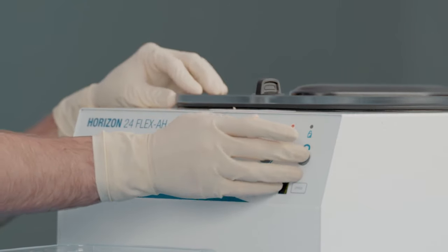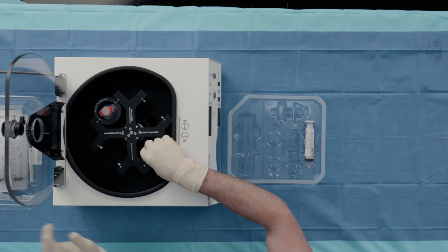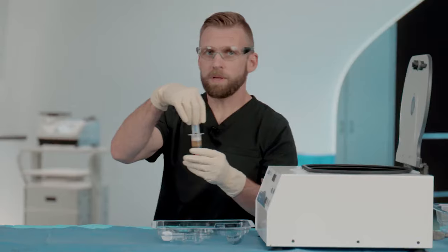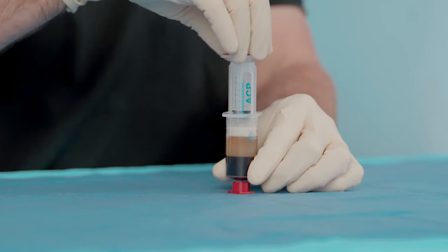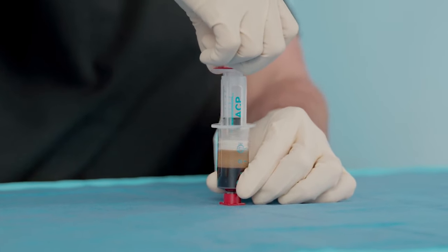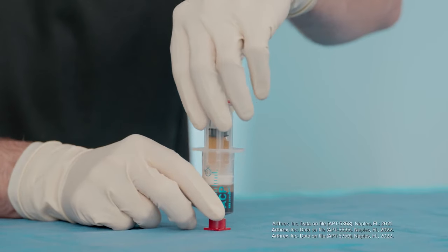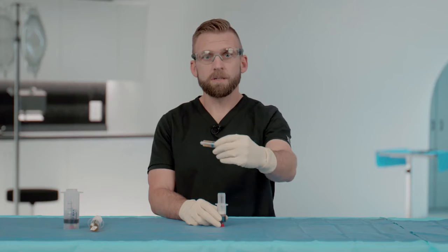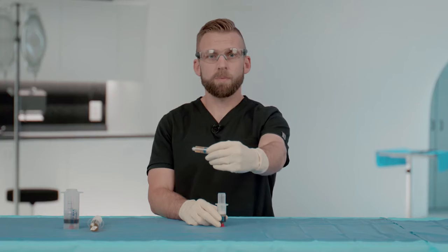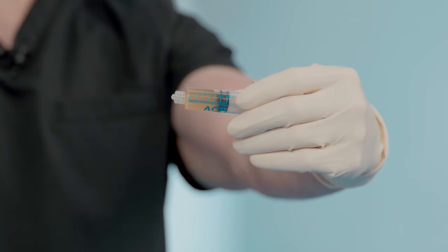We'll carefully place this on a flat surface and then use the internal syringe to pull the PRP, stopping short of the RBC layer. Through this process, the ACP Max system can deliver a highly concentrated PRP up to 12 times over baseline platelet concentration, devoid of neutrophils.